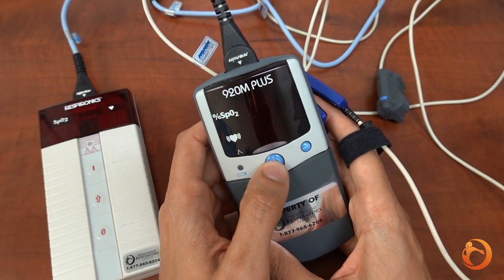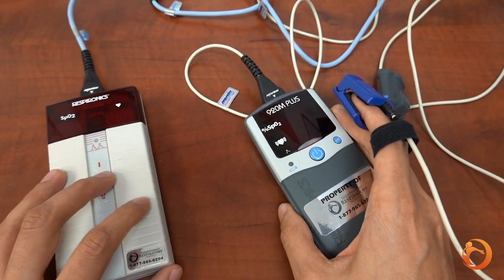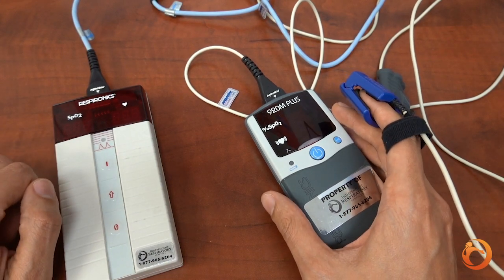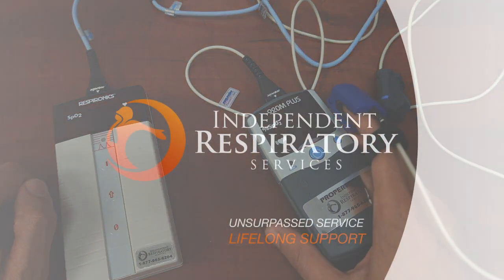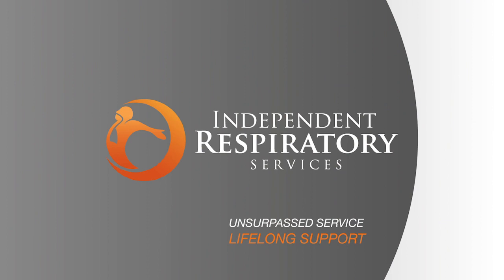The test is usually done for two nights. Place the oximeter in the bag and arrange to return it back to your office as agreed. Independent Respiratory Services will send the report to your referring specialist, physician or other healthcare practitioners. For any questions, please contact your local Independent Respiratory Services office.